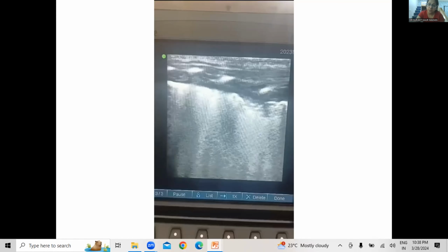And in pulmonary hemorrhage, do we have that uniform kind of whiteout lungs all the time? I think if you had an acute pulmonary hemorrhage, yes. And again, it's clinical correlation. So there's nothing that's really pathognomonic of it. If you have blood coming up the ET tube, in some babies, there's this description of silent pulmonary hemorrhage.